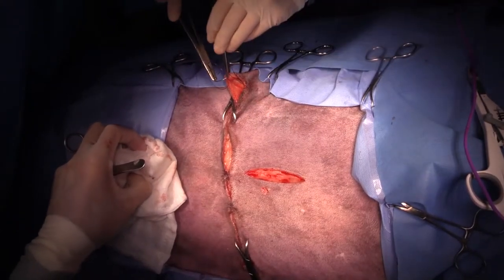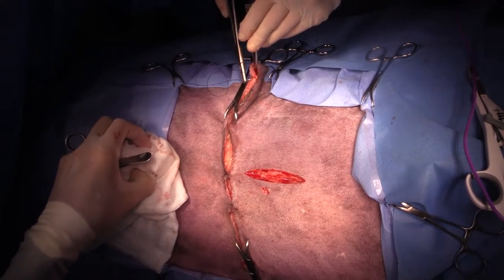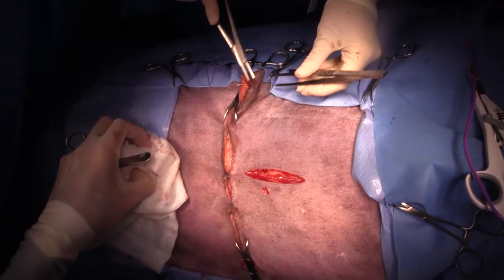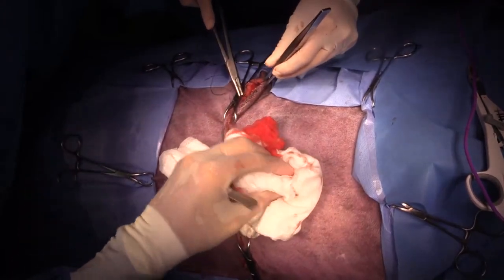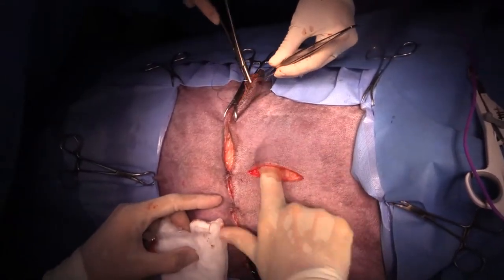So I'm doing an intradermal mattress suture. And a bolster bandage. I'm not sure what a bolster bandage is. Do you know what it is? No. Somebody's mentioned a bolster bandage. I'm interested to hear what that is.